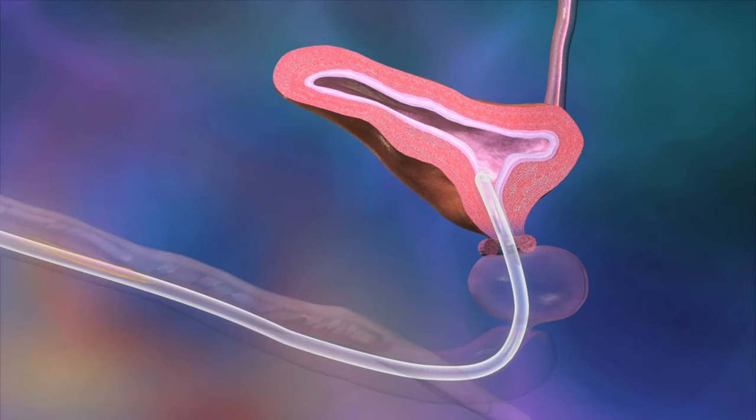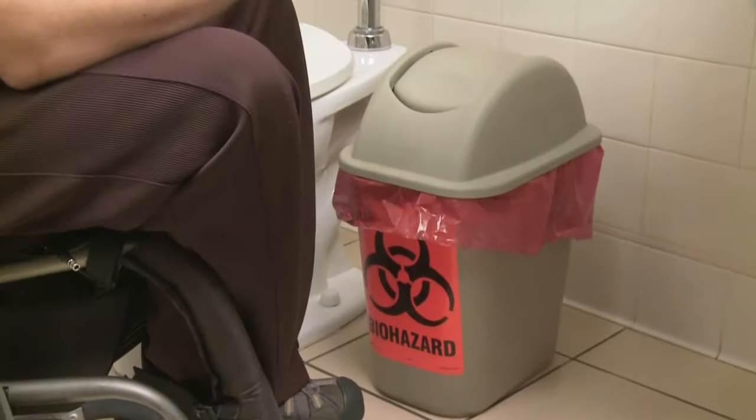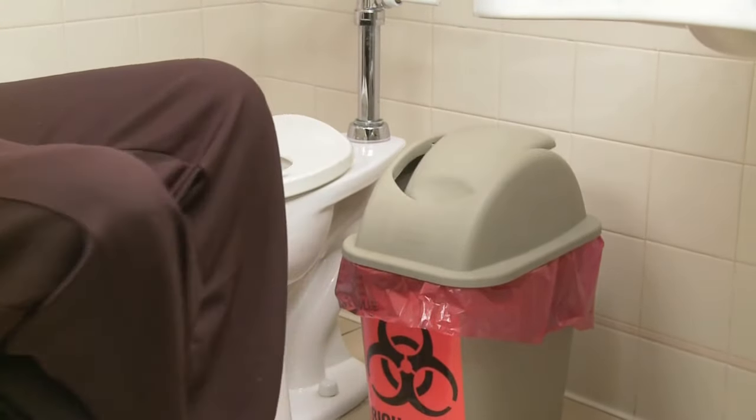When your bladder is empty, withdraw the catheter completely, bending the tubing slightly to help prevent dripping. Dispose of the catheter properly along with the product packaging. Never flush the catheter down a toilet. Finally, wash your hands with soap and water.